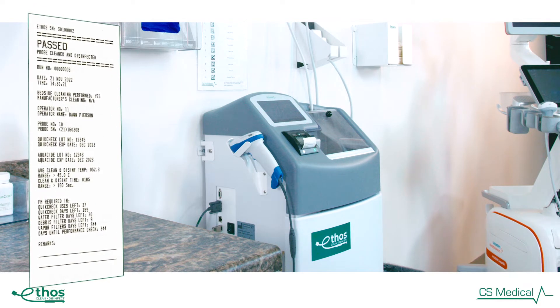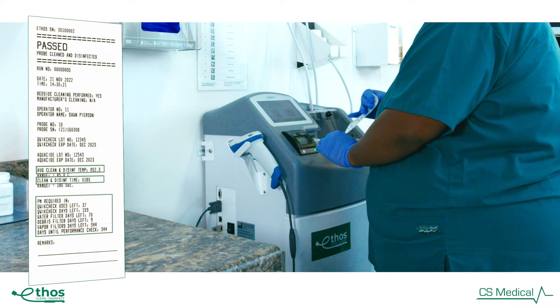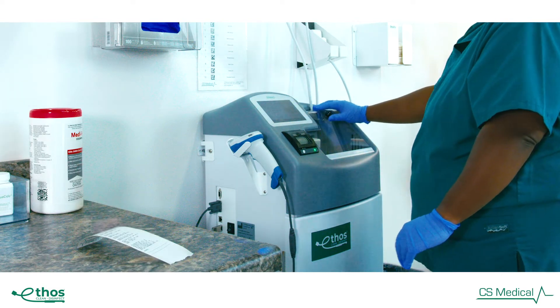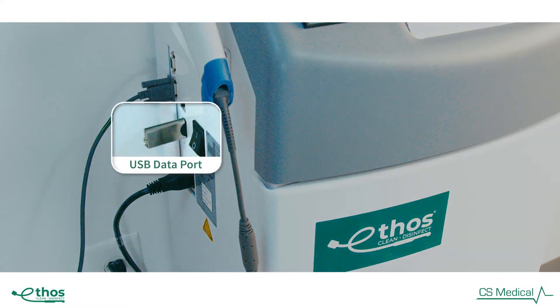Once the reprocessing of the probe is complete, Ethos provides a printout that outlines all the parameters of the reprocessing procedure, which includes contact time and temperature as well as the status of the device itself in relationship to any preventative maintenance that is required. In addition to the printout, all data is stored in the system's memory and can be retrieved for download to a provided USB and further saved externally for record retention or audit.